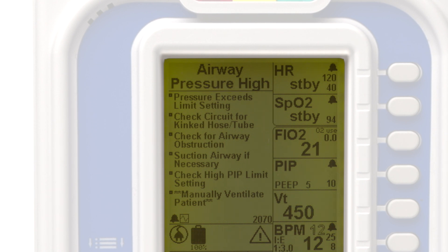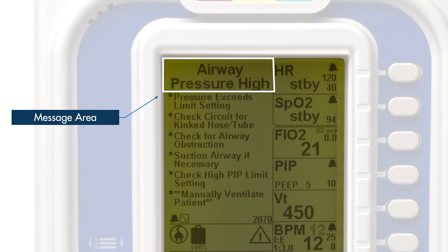During an alarm event, there are several key areas of the display to focus on. At the top left is the message area. During an alarm event, the waveform window is replaced with the on-screen Smart Help alarm instructions.